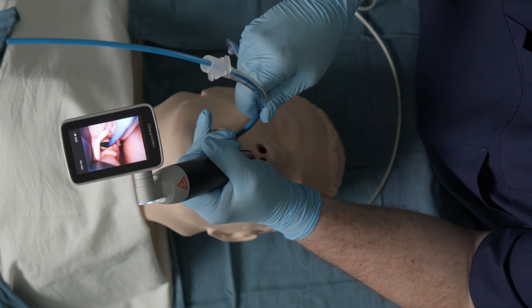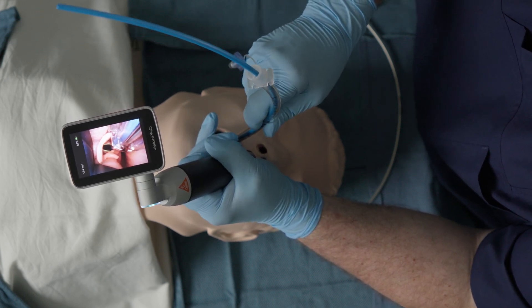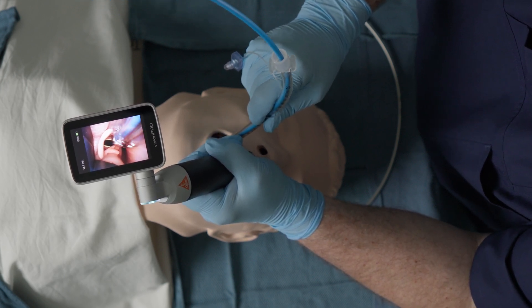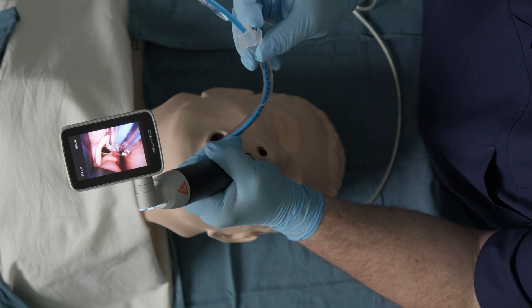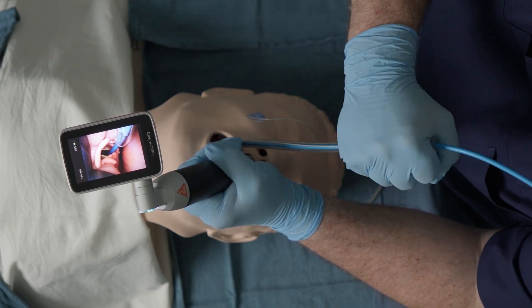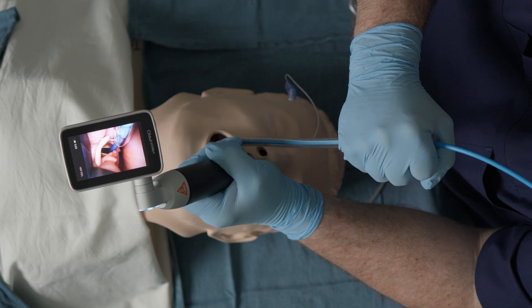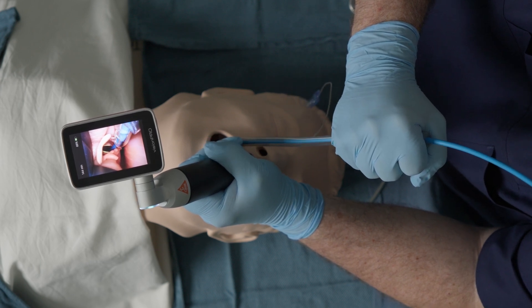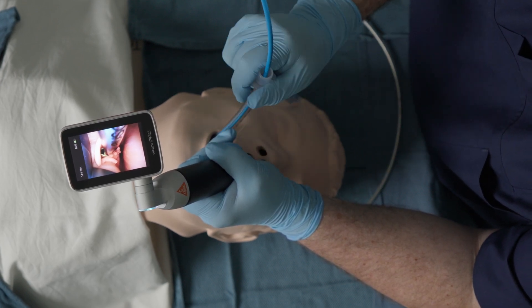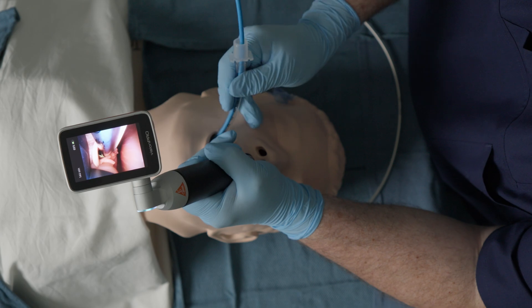I'll go ahead and simulate — I'm impinging now on the right corniculate and the posterior commissure of the larynx and I'm unable to advance the tracheal tube. The fix for this is to disengage from the cartilaginous structure, turn the tracheal tube so that the murphy eye is pointing at the 12 o'clock position, and re-advance the tracheal tube over the posterior commissure and into the trachea.